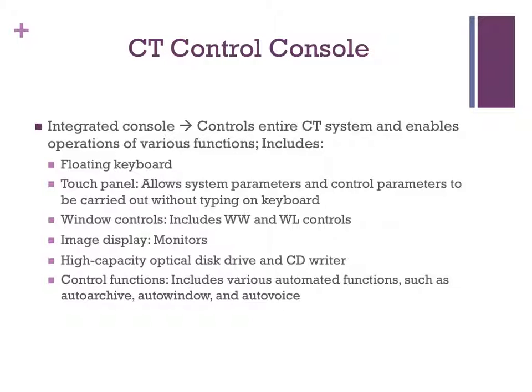The integrated console also includes window controls, such as window width and window level, image display, such as the monitors, high-capacity optical disk drive and the CD writer, and the control functions, which include auto-archiving, auto-windowing, and auto-voice.